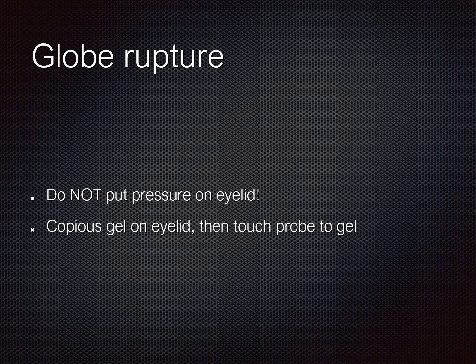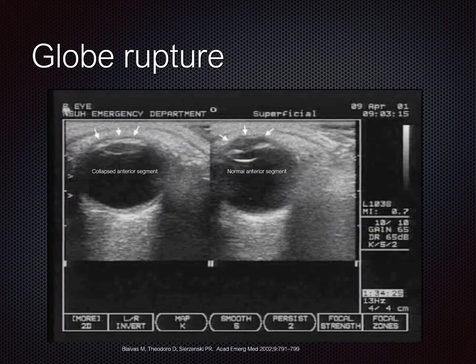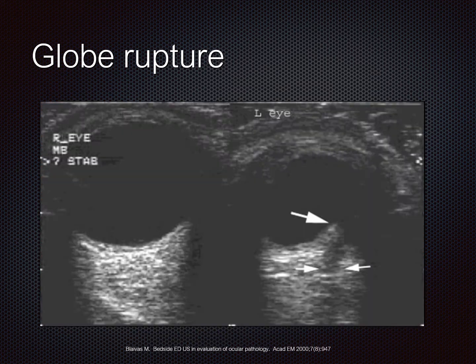and absolute sterile precautions. And what you would see, again, sort of intuitive pathology, is the anterior chamber looking flat, even with no pressure from your hand. That's because that fluid has leaked out. And you may also start to see some folding and deformity of the eye.